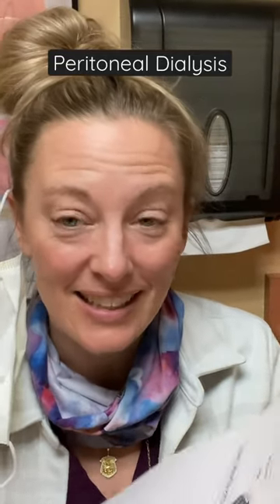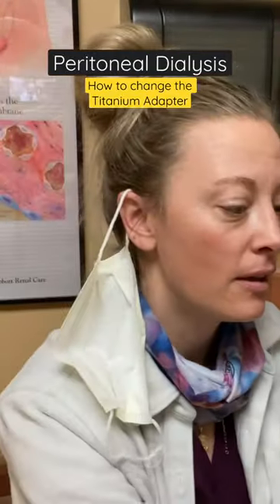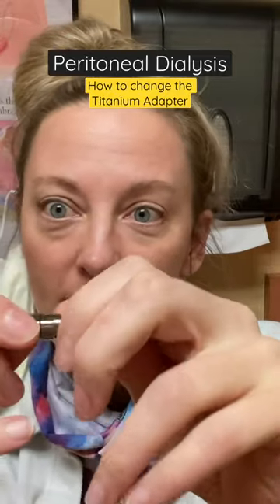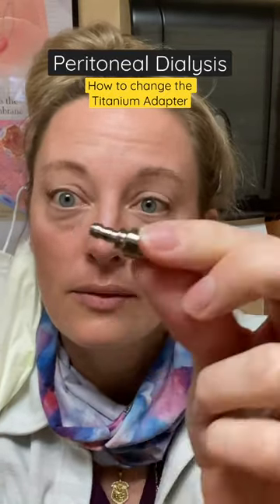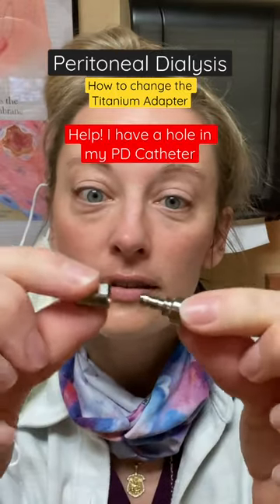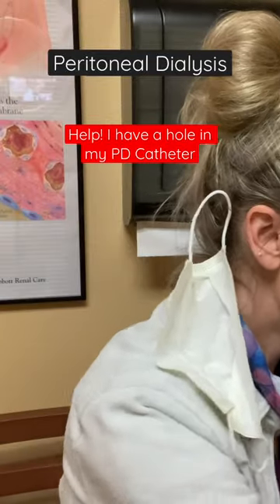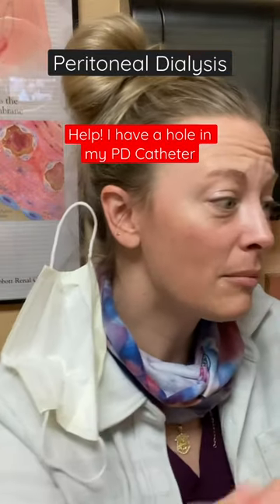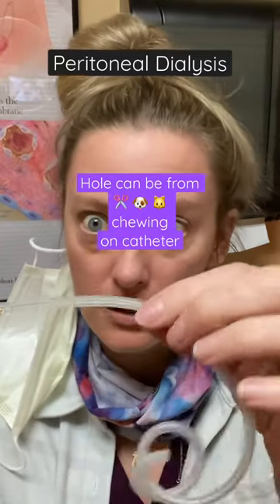This is a peritoneal dialysis titanium adapter — here it is in real life. This is obviously for demonstration only because it's a sterile thing. You will have to change the titanium adapter if somebody calls and says the cat or dog did something to it, or there's a hole, or maybe they cut it with scissors.